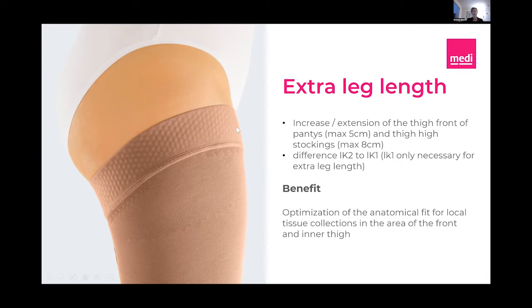So here Medi created this extra leg length, which we determine out of two separate measurements. So we are measuring, it's called LK1, which is the inner third of the gluteal fold. This gives us a length measurement, and also we're taking the measurement of the base of the pubic bone down to the floor. The difference between these two length measurements will tell the production team in Germany how much more length they can add on the inside and front of the stocking, so that the end user can keep tucking in this tissue.